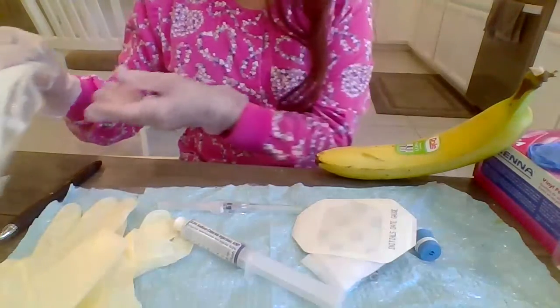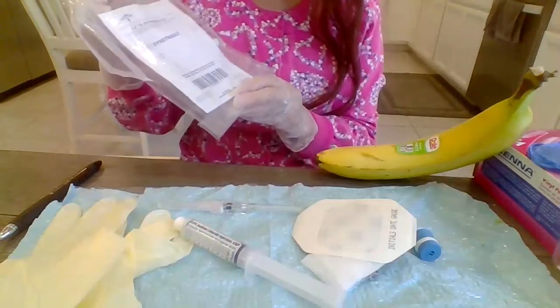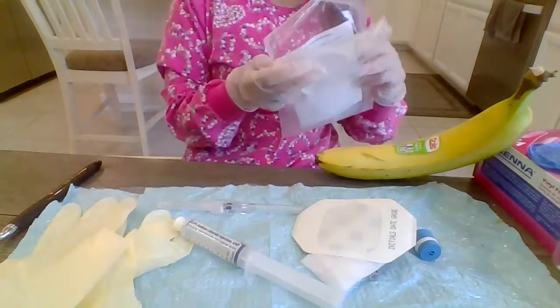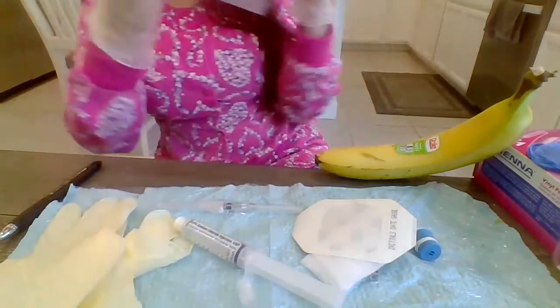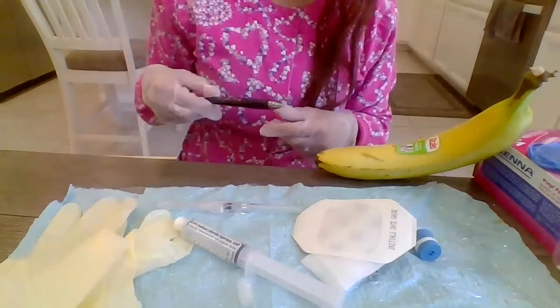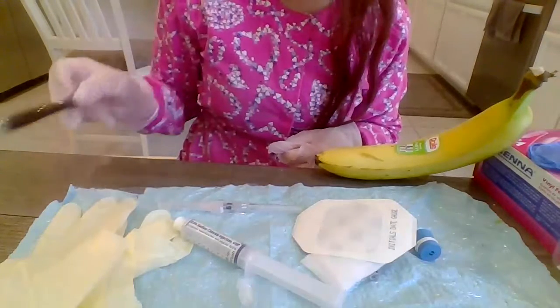And I also have an IV extension kit. I'm going to open it and just drop it here. I also have a pen because later I'm going to use it for labeling my IV site.